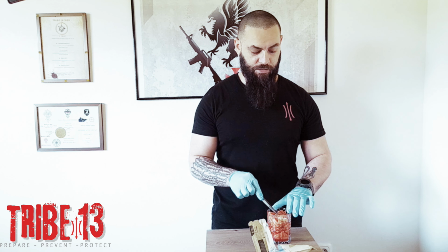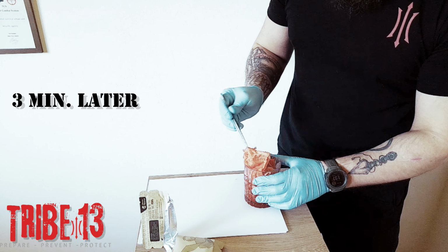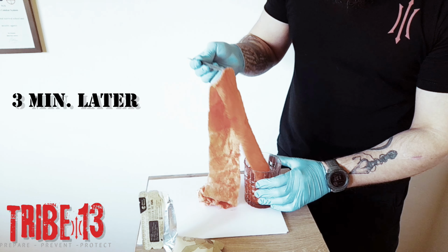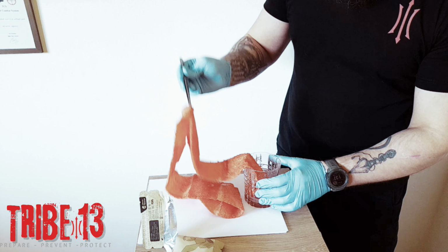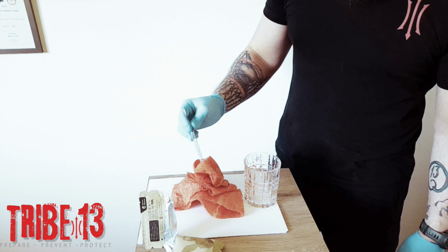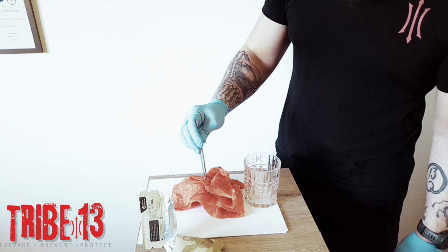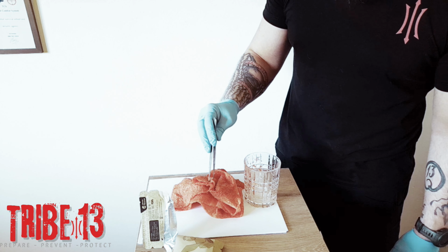So now I'm letting it like 3, maximum 5 minutes, and we see what is the result. So I will take now all out so you can see the result. So all the liquid, it was impregnated in the gauze, and this basically it will happen also in a massive bleeding with the blood. It will help the blood clot faster, coagulate faster.